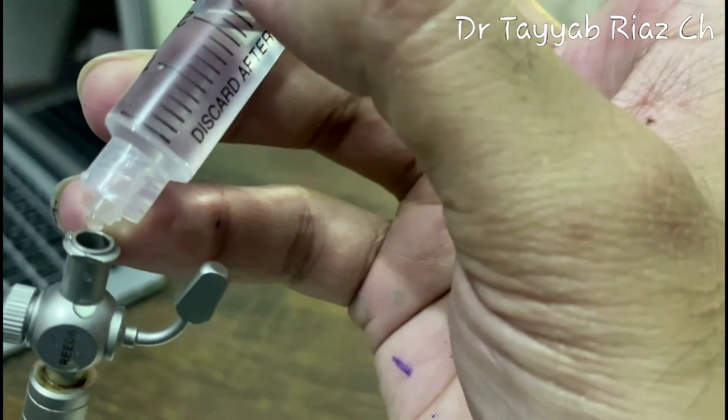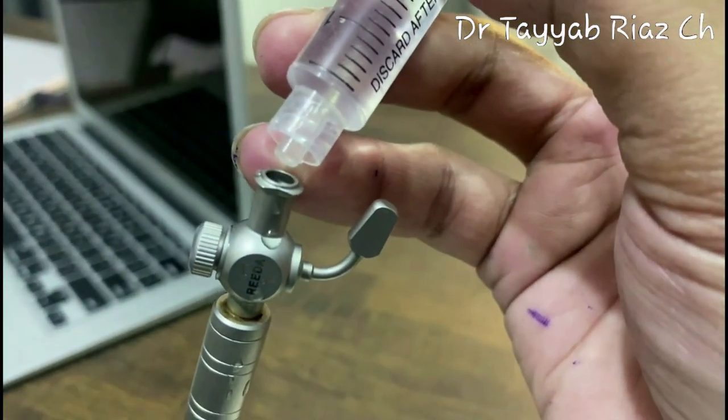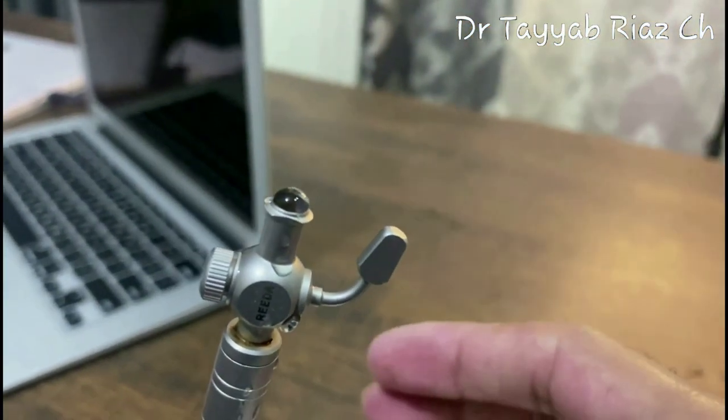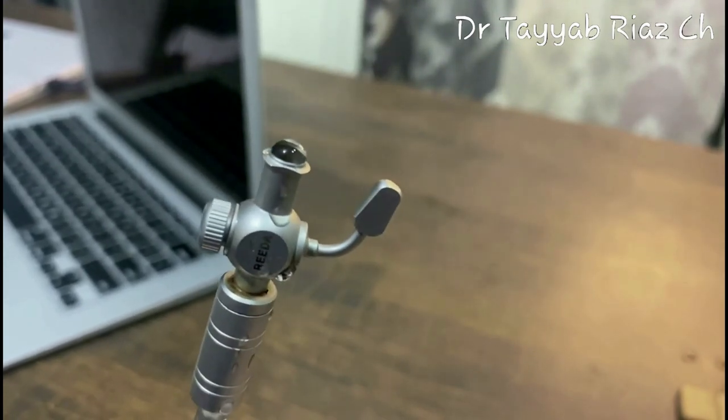And now the hanging drop test. Just put 2 to 3 drops over the opening of the stylet, and if the drop is hanging like this over the opening, it means you are in a blind space, like in the preperitoneal cavity in our current scenario.